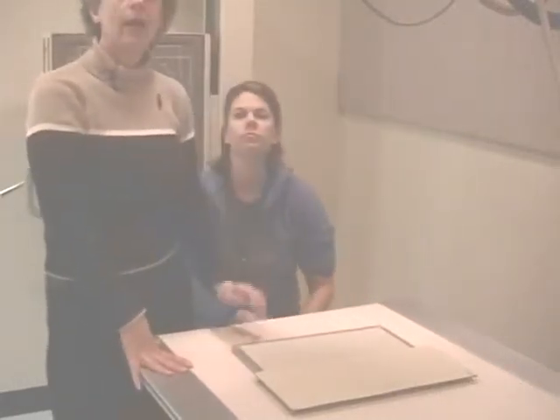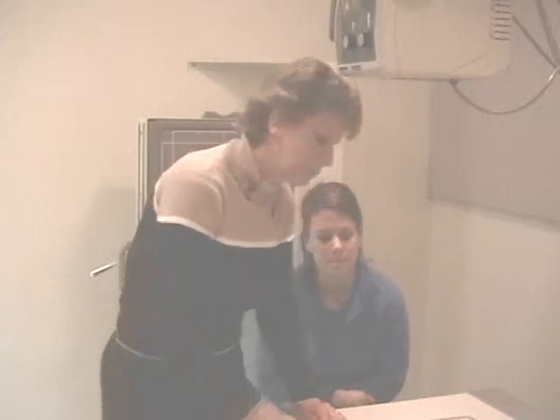And again, this was a distal forearm. I put the carpal bones 1.5 inches from the film's edge. With this particular patient, if you had a shorter arm, they could be a little further from the film's edge. With a longer arm, go with the 1 inch from the film's edge, not closer, or you'll be clipping pertinent anatomy. That was a distal forearm.